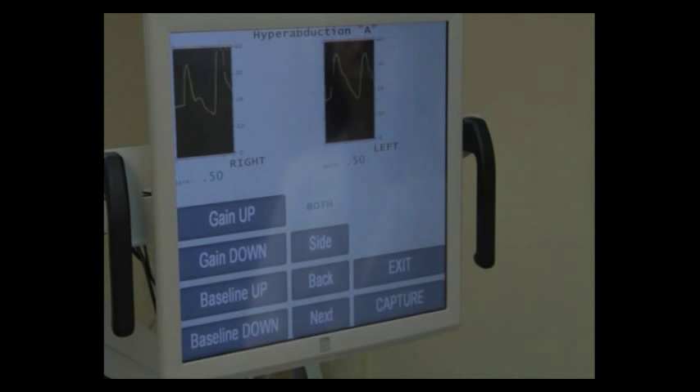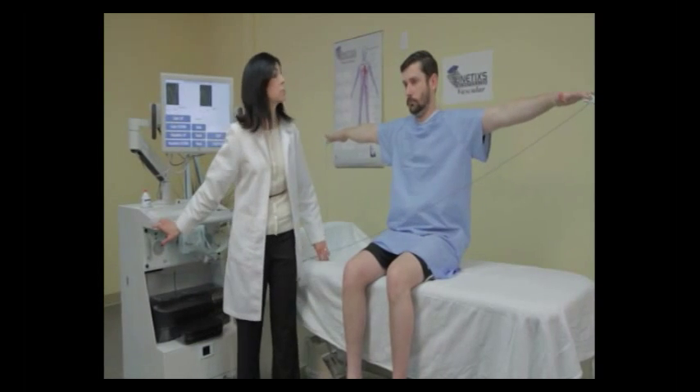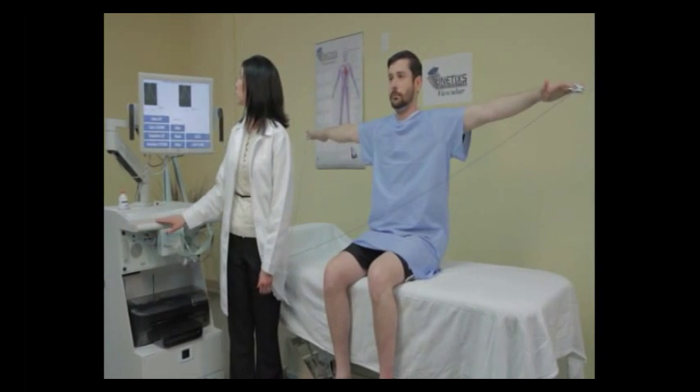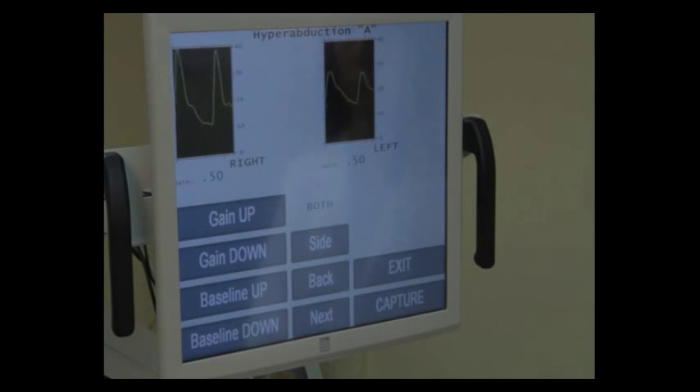The next position is called hyperabduction A. Ask your patient to take their arms and put them straight out with the palms facing the ground. Observe the on-screen waveforms. Wait for them to settle down, and when they stop getting bigger or smaller, press the capture button.